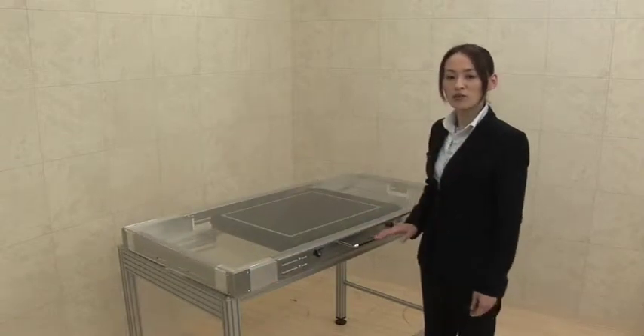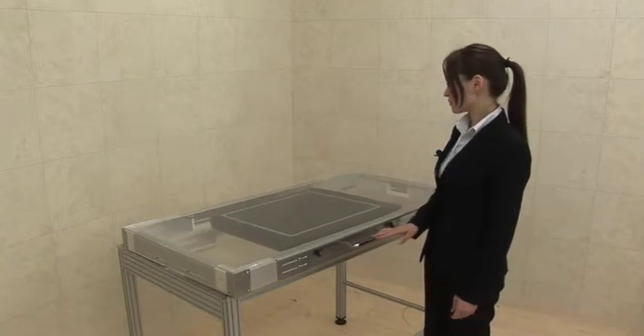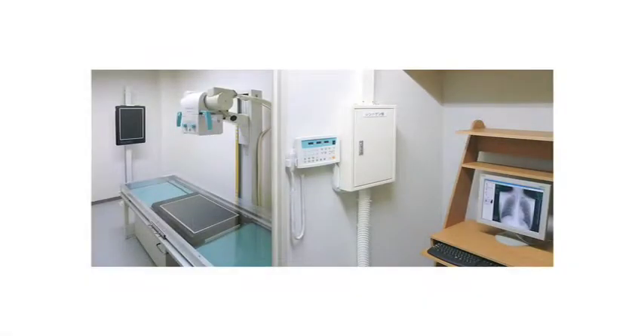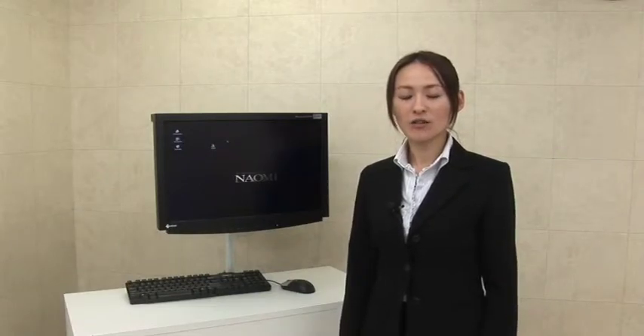You can move the Naomi sensor left and right. As you saw, the setup is very easy and simple, because it does not require any complicated wiring or office modifications. Now all the setup is done.